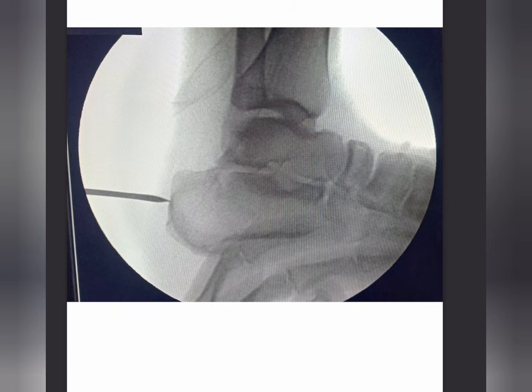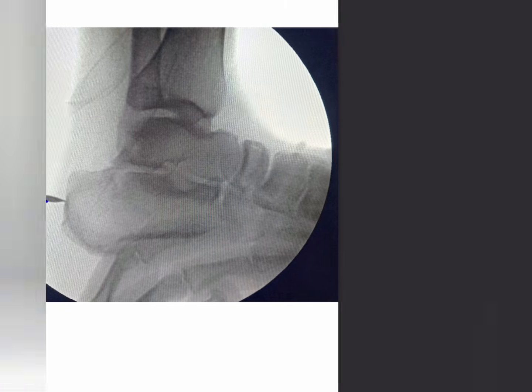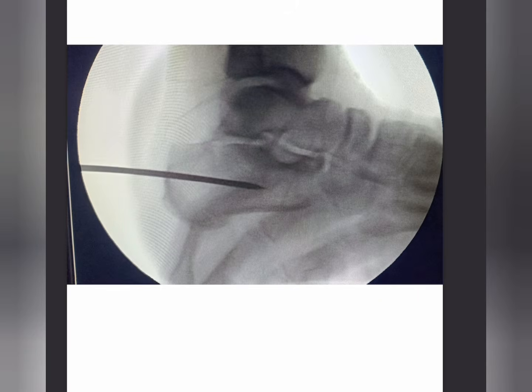We insert the Steinmann pin just lateral to the calcaneal tuberosity. Just laterally over the calcaneal tuberosity, we insert the Steinmann pin. The pin is advanced up to just below the posterior facet. You don't go further, because this is how we are going to reduce. I'll show the maneuver in the clinical intraoperative video which I took. Okay, so you don't advance it more than the posterior facet. Okay, so the pin has been advanced.